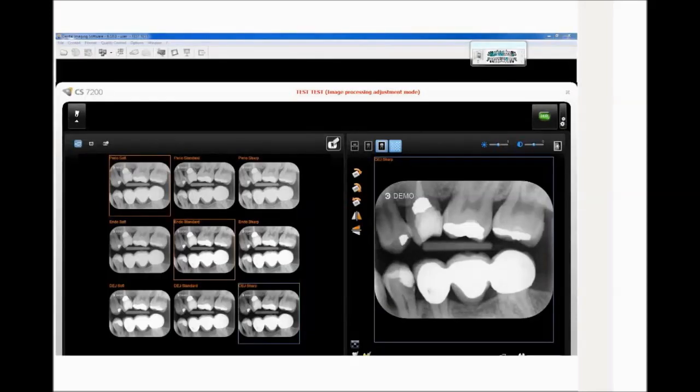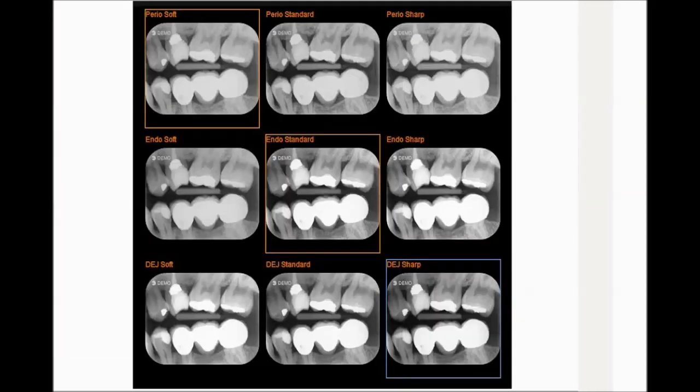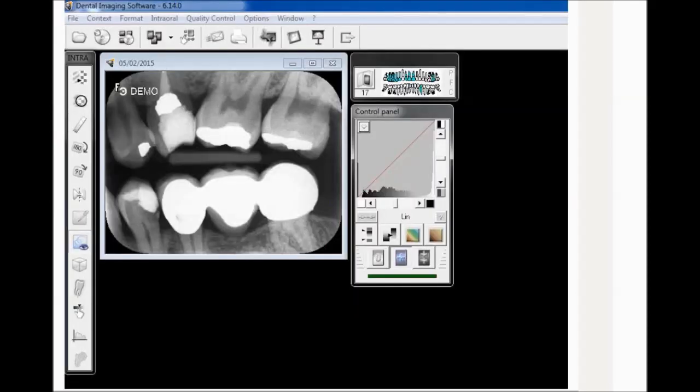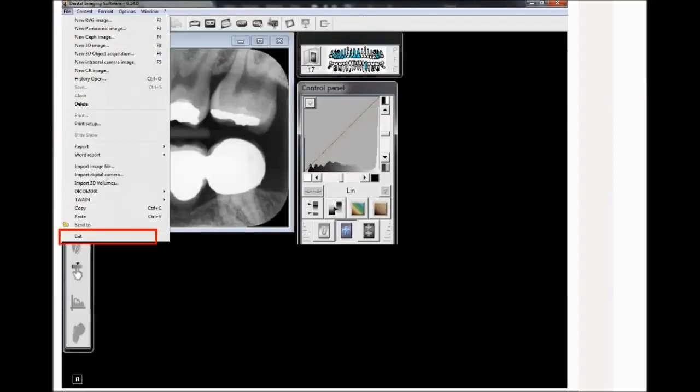Select the preferred look for each image of the dental structure. The selected look is shown in an orange frame. The last selected image is in a blue frame and is set as default. Close the window. The selection confirmation window is displayed. Verify the default filter in dental structure selection. Select the default resolution. Click OK to confirm and save the selection, then click OK again. The Dental Imaging Software window is displayed. Click File, then Exit to close the software. This is the end of the adjustment procedure — the scanner is now ready.